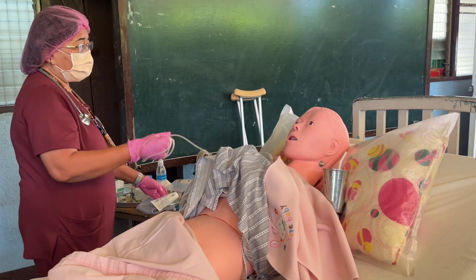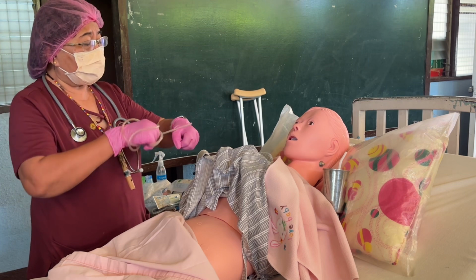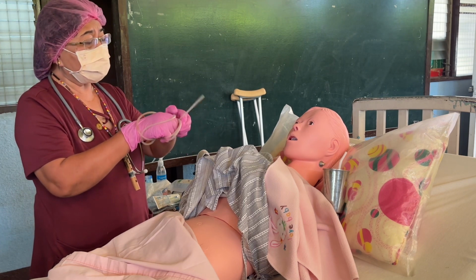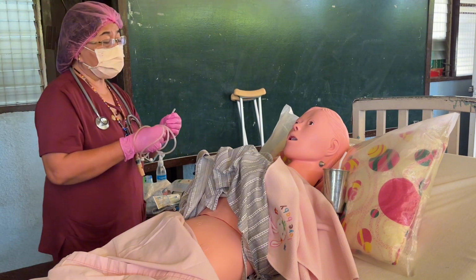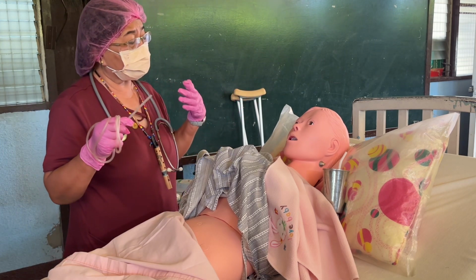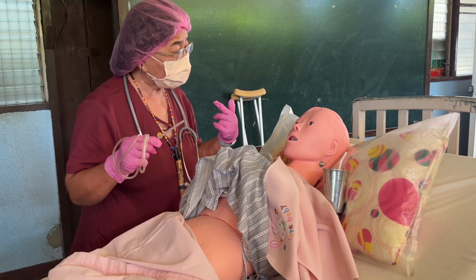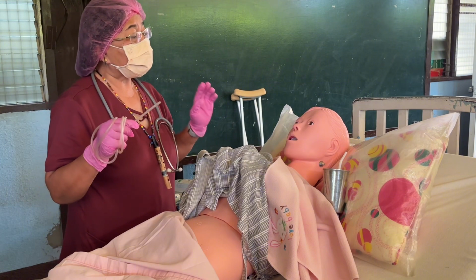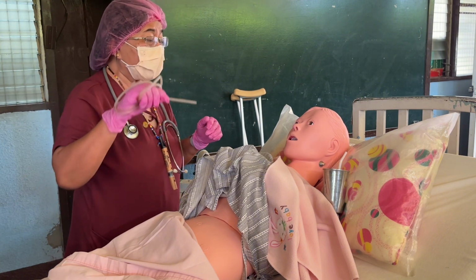Your white jelly. At least 3 to 4 inches. So, put lots of it to avoid difficulty in the insertion. Lots of KY jelly. And then after that, you instruct the patient, ma'am, just relax in breathing. You breathe through the mouth. Then when the tube reaches your throat, kindly open your mouth. I'm going to check if the tube is not curling in your throat. And then please sip water so that the advancement of the tube will be easier.